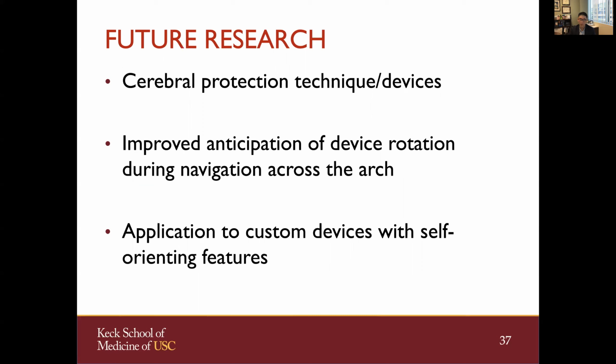Really, I think we need a way to better anticipate the device rotation and the interaction between the device and the aortic arch and hostile anatomy. And also more wide application of custom devices with self-orienting features, I believe, is the key to safer, technically easier procedures across the aortic arch.